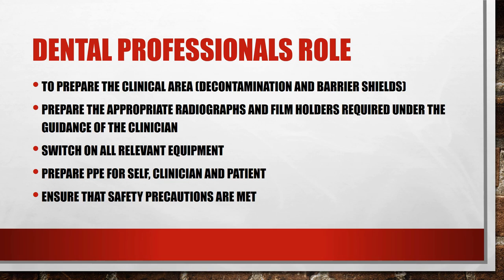Correct PPE must not just be used by the dental professional, but also the patient should have the appropriate PPE on. We must also ensure that safety precautions are met and kept during the whole process of taking the radiographs.